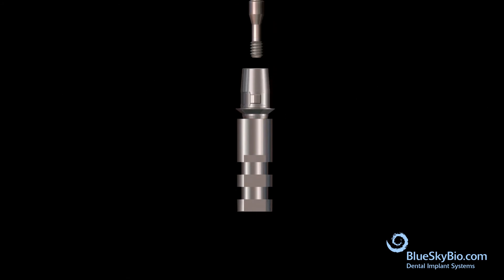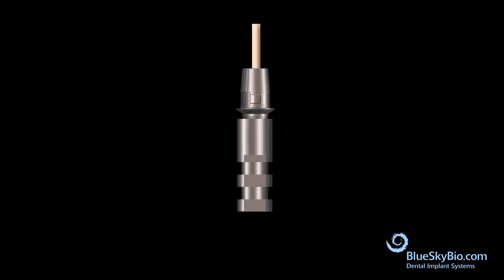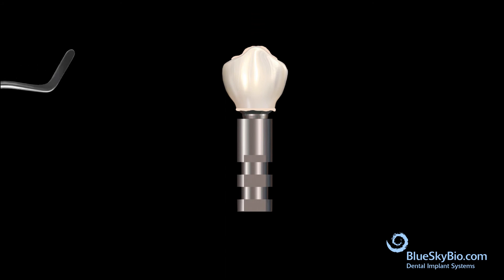Insert the titanium base abutment into an implant analog and screw with light pressure. The wood end of a cotton tip applicator is inserted into the abutment screw channel to keep it protected. Insert bonding material into the crown and bond the crown to the abutment. Remove the wood stick and remove any excess bonding material.